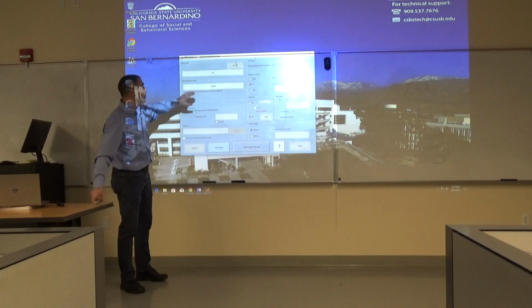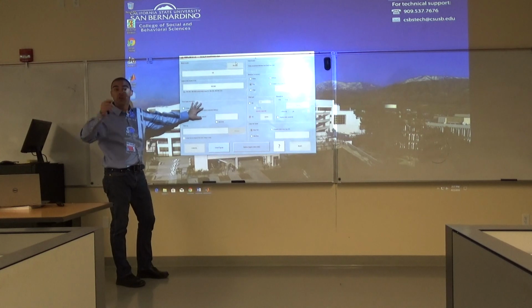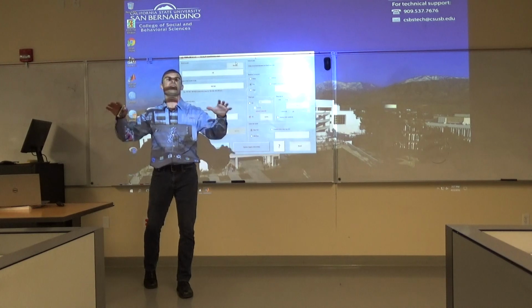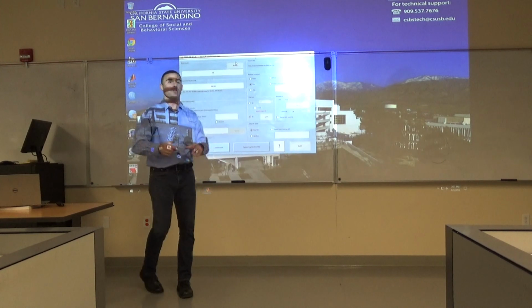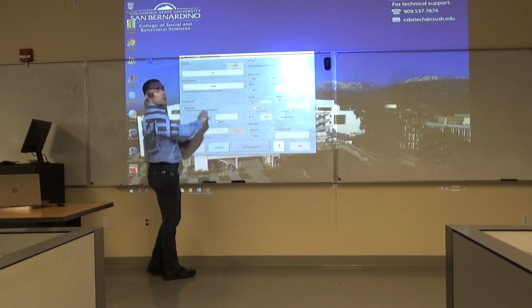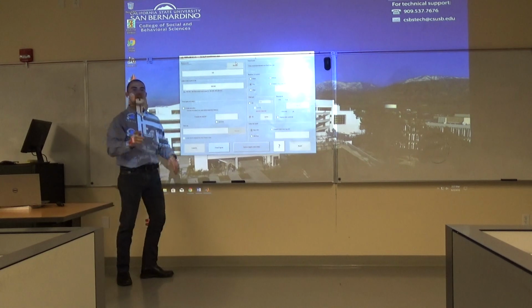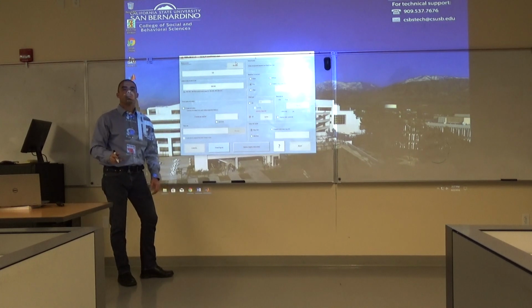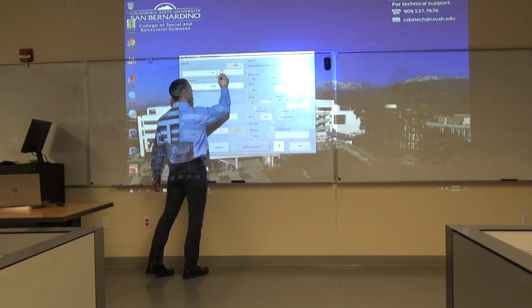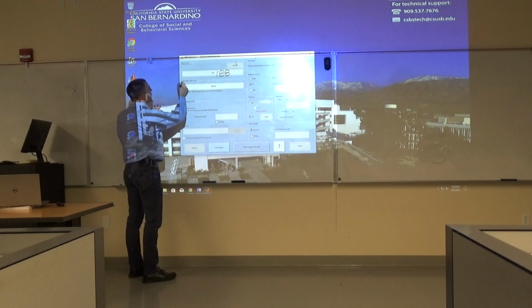Okay? So, it's going to ask us a couple pieces of information, because you guys are going to be able to plot this. Now, we're going to get into this through the rest of the quarter, so I'm just going to give you the information now. So, in this first bin, it's going to ask for a number, and those numbers correspond to different memory conditions. Don't worry about that now. Type in the number, for fun right now, do 188.